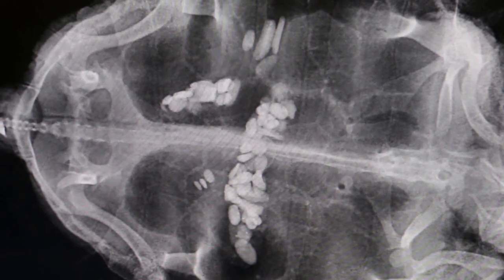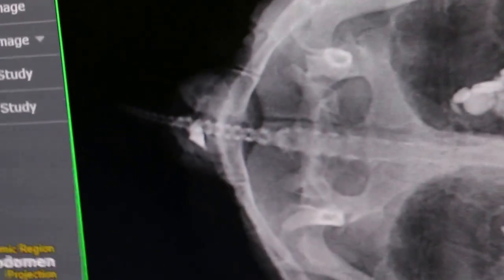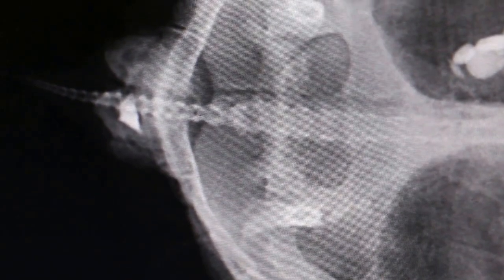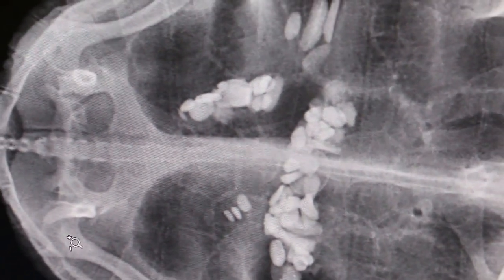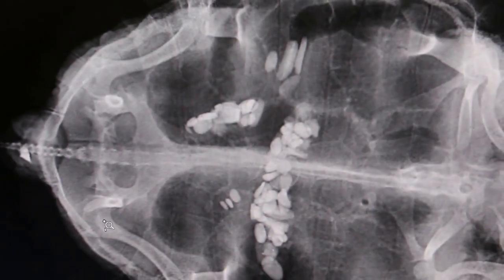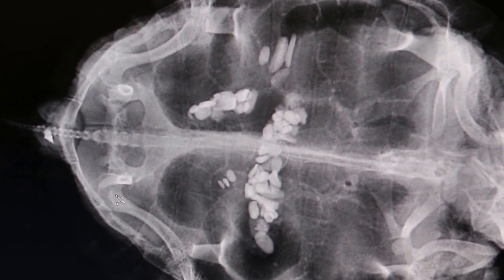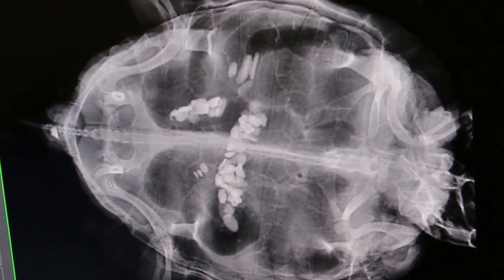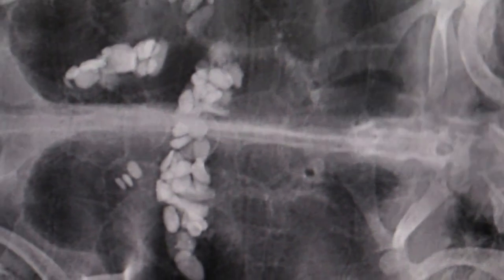The two uteruses don't have big eggs. The egg got stuck at the cloaca and we removed it. This could be leftover shell. We will take out the shell, and after that take out the egg — after it ruptured, the urine and stools all came out because there was obstruction by the egg. The well-formed egg was about the size of a quail egg or small pigeon egg. You can see the shell is still stuck there.